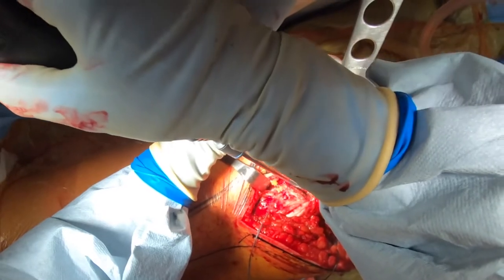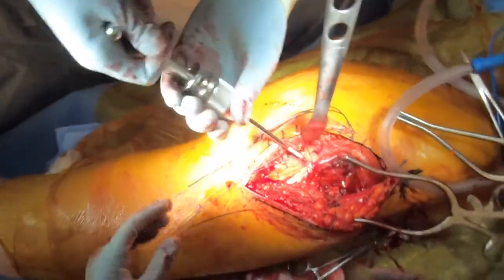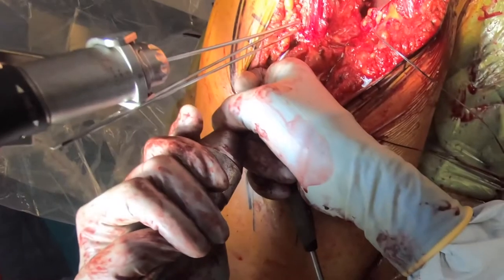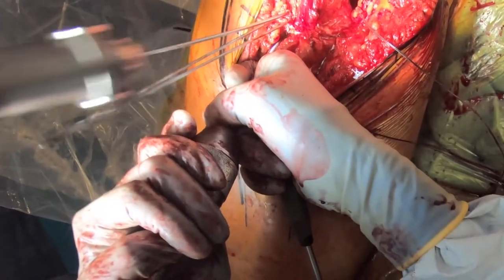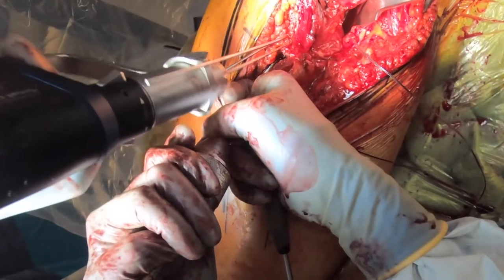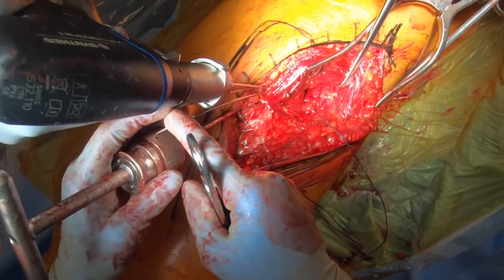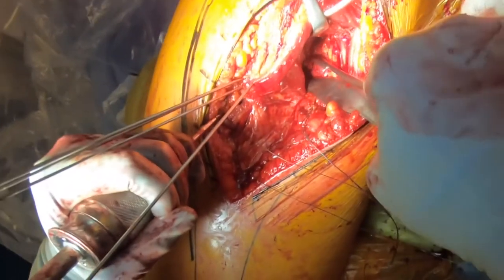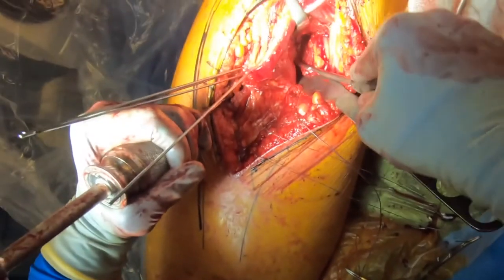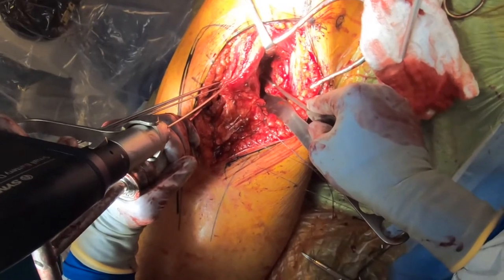A 5.0 mm Schanz pin is then placed in the femur to allow for reduction. The femoral neck is then visualized and K-wires are then preloaded just proximal to the fracture site. The reduction is then obtained and clearly visualized with use of an internal rotation force, longitudinal traction, and posterior translation of the femoral head with use of a cob.